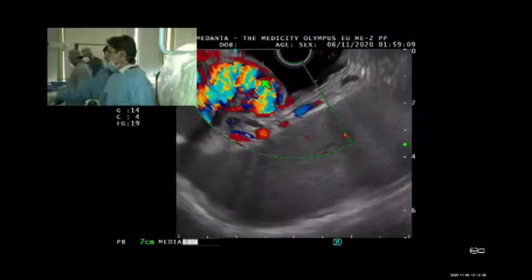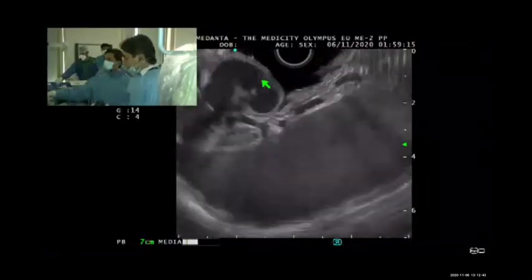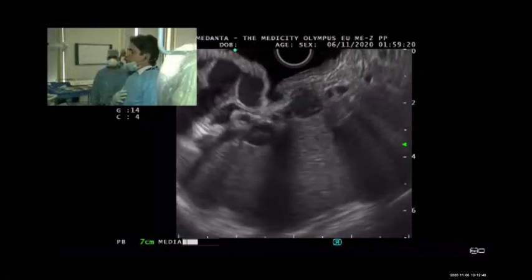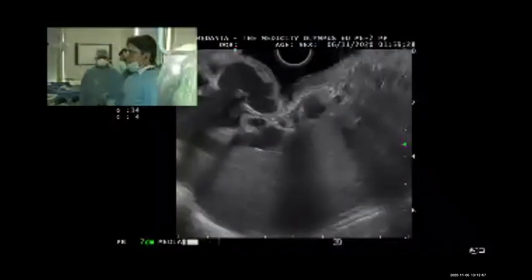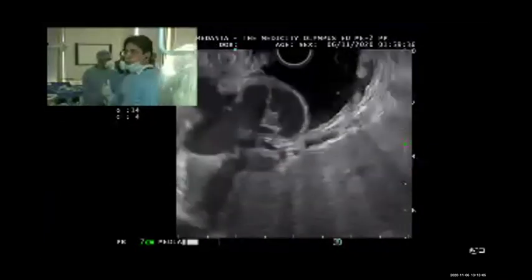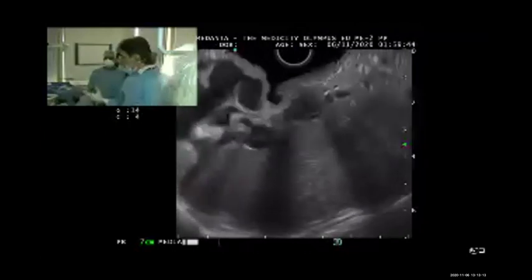And what would be your indication in routine practice of using this technique, coil and glue? Yeah, very good question, Pankaj. I think it's a very good question you raised. The common indication in my practice, I don't do all the fundal varix with the EUS coil and glue. My practice is patient with the large fundal varix who has failed endotherapy, with the child C cirrhosis, or patient who has encephalopathy, patient with the child C cirrhosis who don't have a shunt, because for BRTO, you require a large shunt.